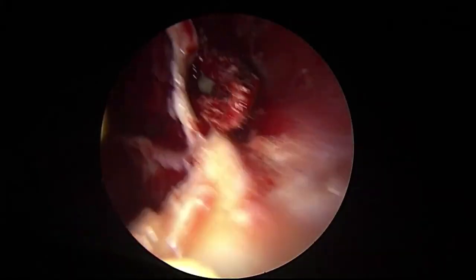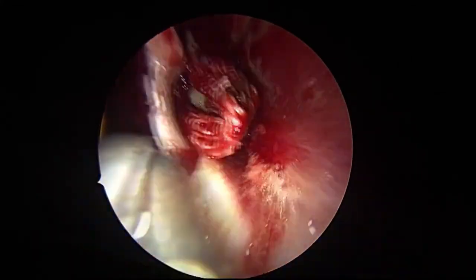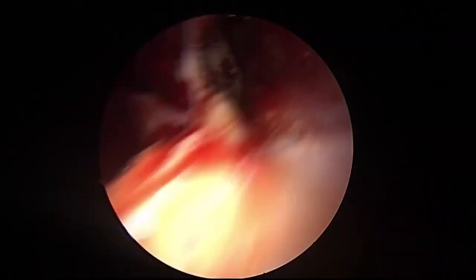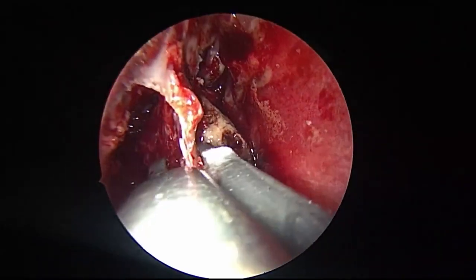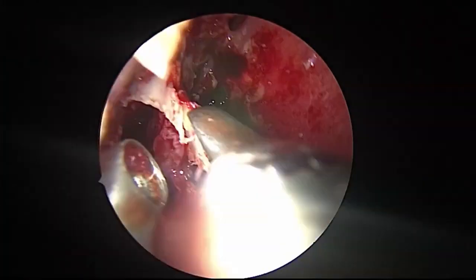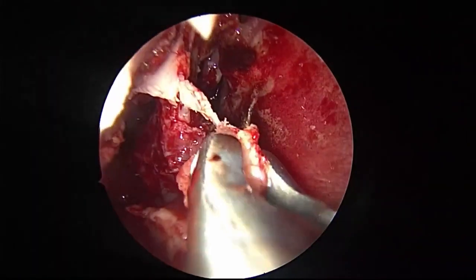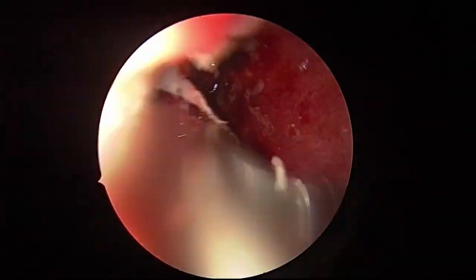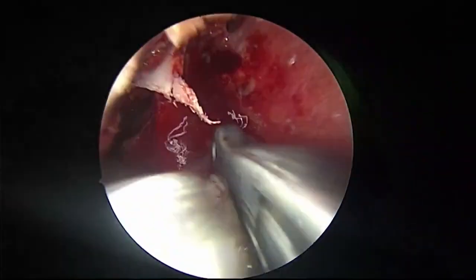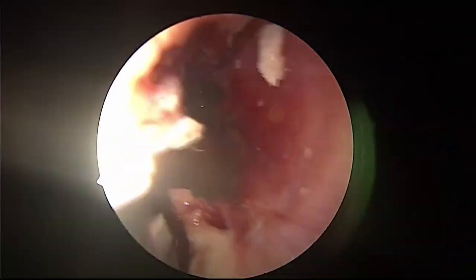Now, see this. This bone I can remove now until the nasolacrimal duct. Behind, that is the NLD. Very clear? Nasolacrimal duct.